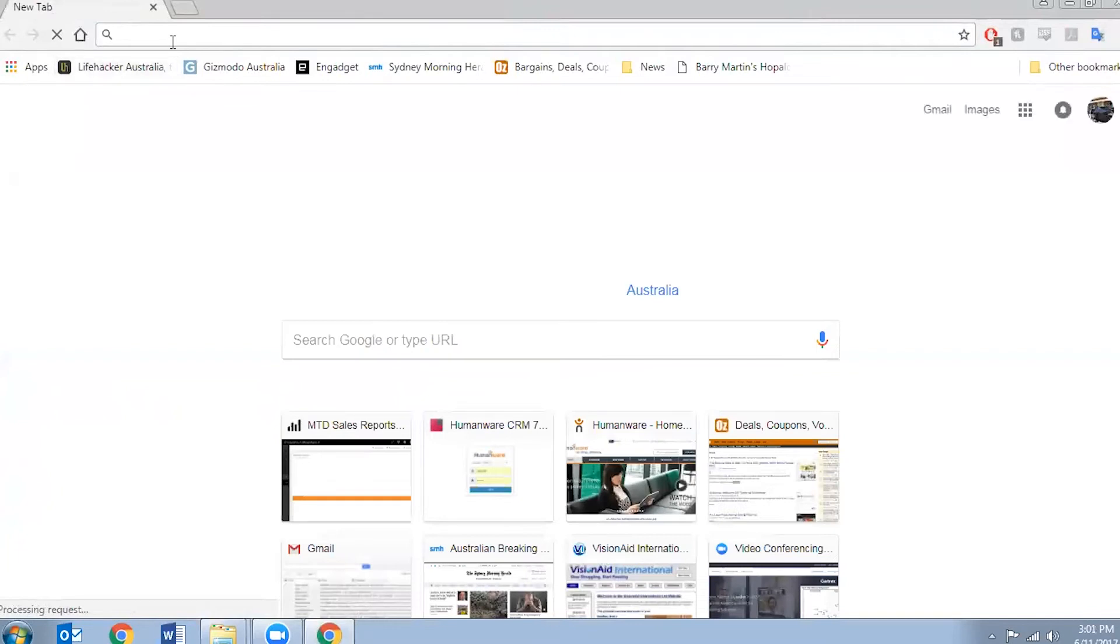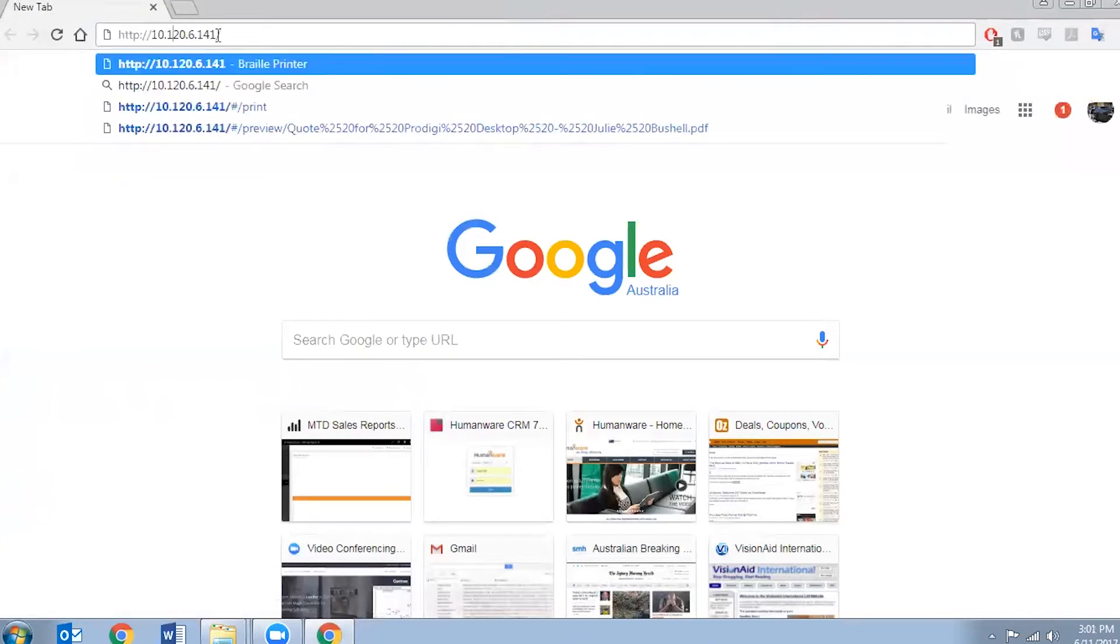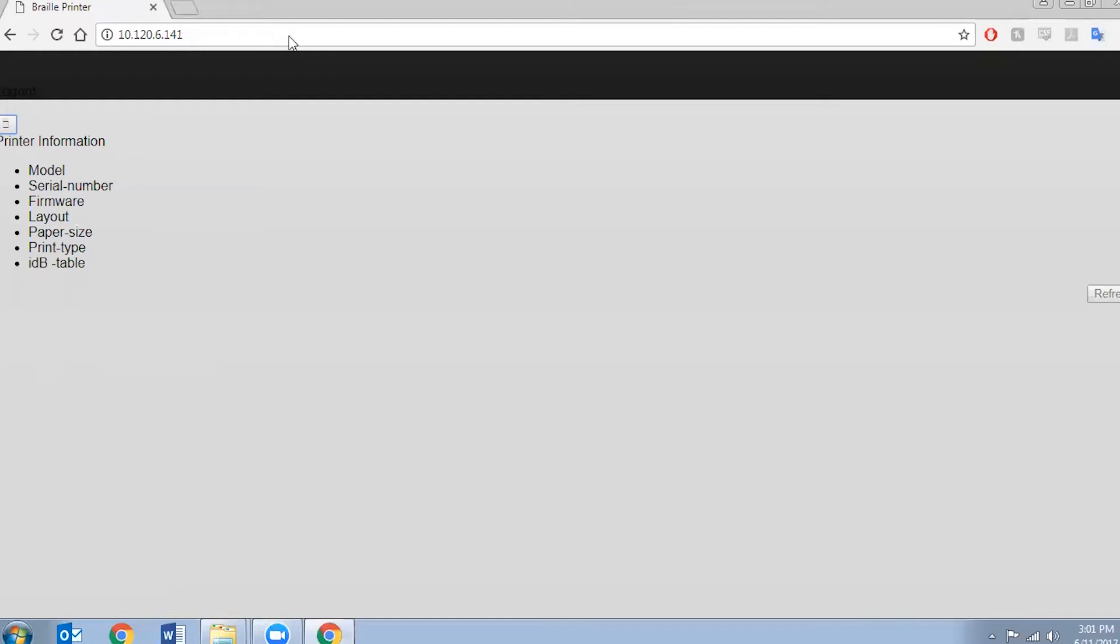So I've just opened my web browser and I'm going to enter in the IP address which is the same as the Braille embosser printer. Key that in and that's what I'll see on my screen.